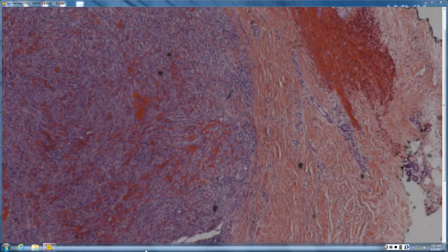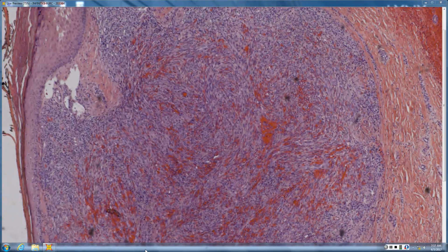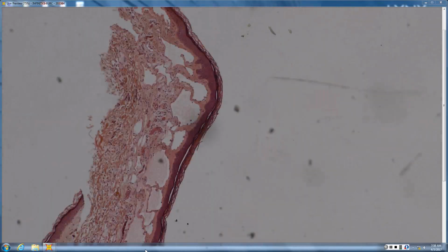So, angiosarcoma, very good. This one has more of a nodular look to it, very spindly, like a nodular KS. So it's a nodule composed of spindle cells and erythrocytes, between those spindle cells no identifiable vascular space. So that is a typical nodular KS. Like a lymphangioma, superficial, dilated, staghorn-like spaces filled with pink lymph.